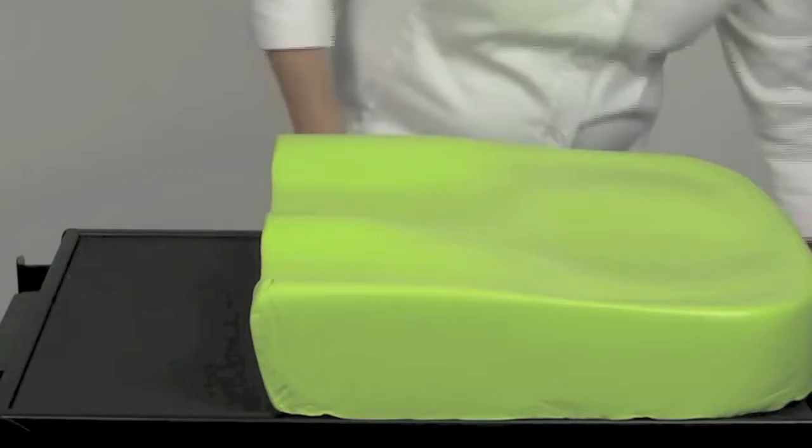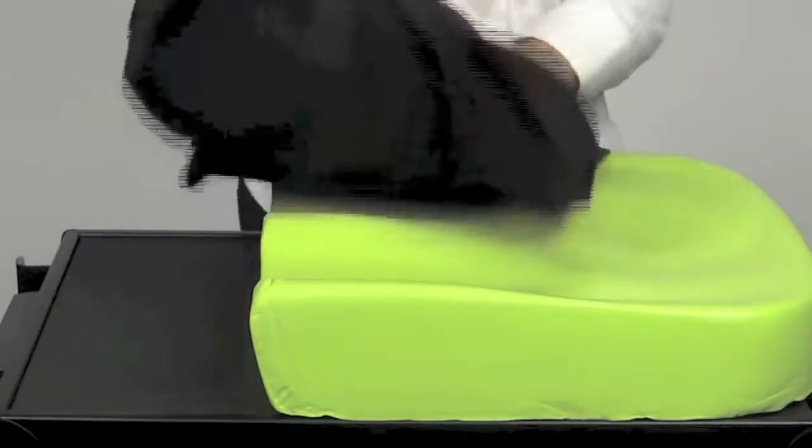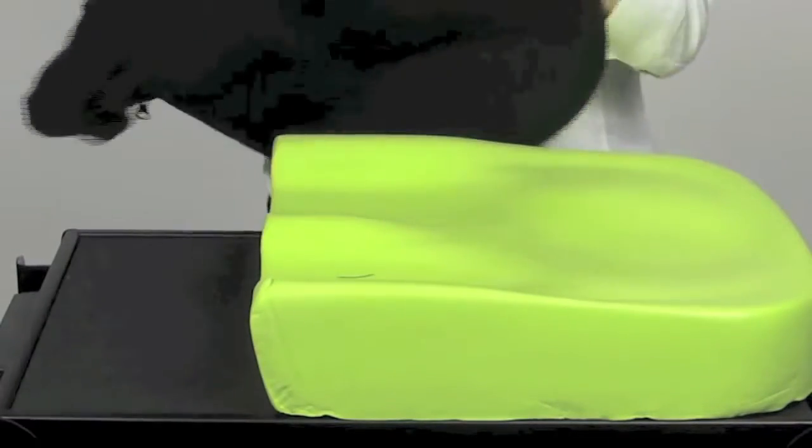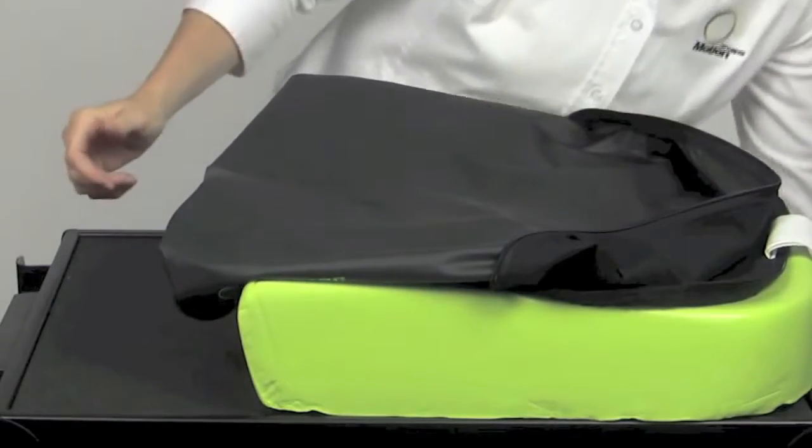A reversible Dartex cover is standard on all pediatric and regular adult sizes and can be used fabric side out or smooth side out. On heavy duty sizes, you must specify smooth or fabric side out.